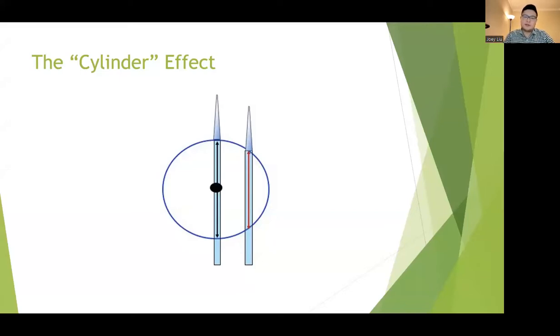And if we're off axis a little bit, the diameter might be less than the true diameter, versus when we're actually on axis. This is important because sometimes with image capture, we could see a glimpse of the IVC and think we're on axis, but then we get off axis when the patient's respiration changes our position.